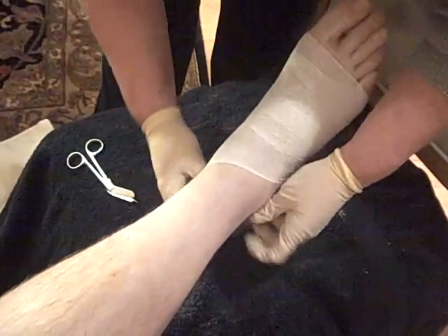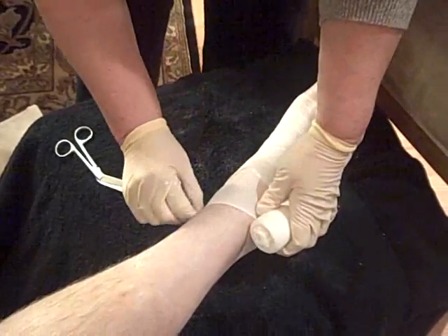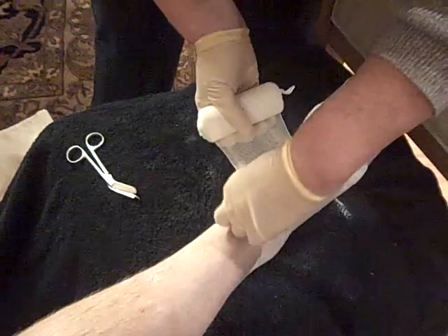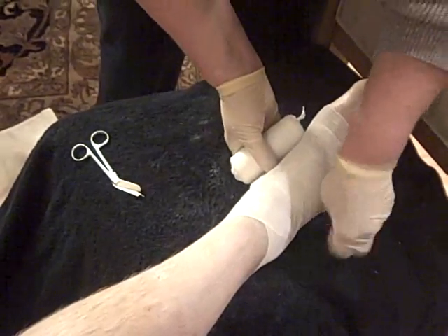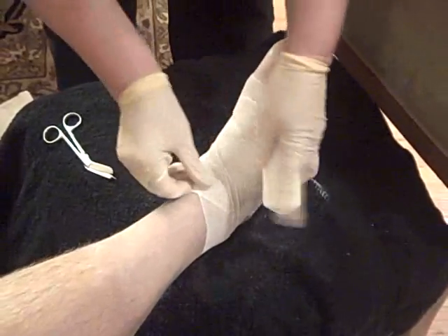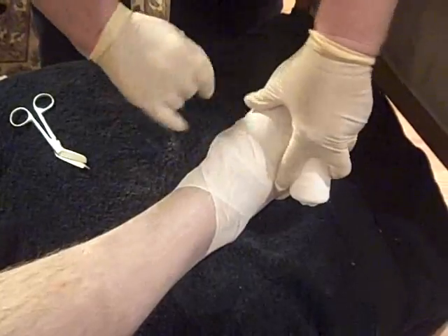The key about an Unna Boot is that you want to make sure that the person you're applying it to is able to move. An Unna Boot is what's called a short stretch. In order for a short stretch to work, you have to work. It has a very low resting compression, so you're going to get all of your compression and the bulk of the work done when you're working with it.